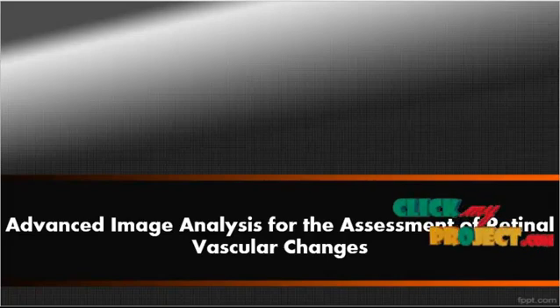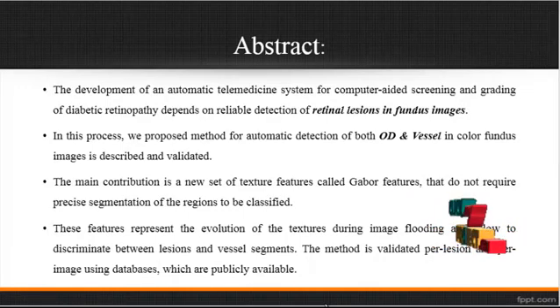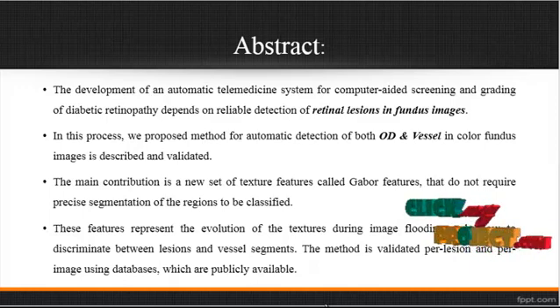Advanced Image Analysis for the Assessment of Retinal Vascular Changes. Now we are going to discuss the abstract for the process. The development of an automatic telemedicine system for computer-aided screening and grading of diabetic retinopathy depends on the reliable detection of retinal lesions in fundus images.